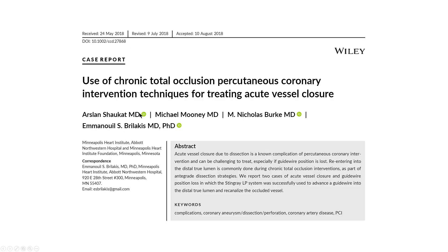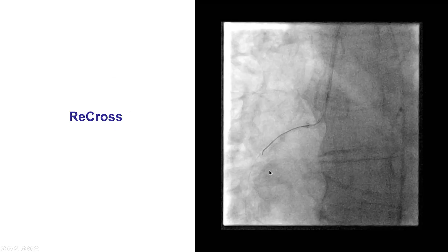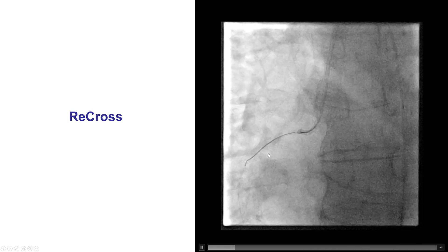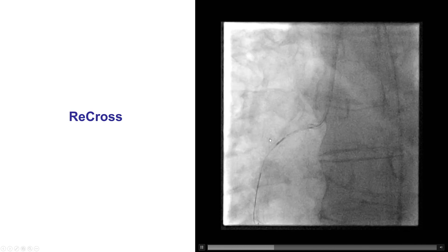What to do for cases like this? One option, since we did not have any EKG or ST segment changes, would be to just stop the case and bring the patient back after a month or two, allowing time for the dissection to heal — that would probably have been a fine choice. The second way is to try to get a wire into the distal true lumen, and sometimes CTO techniques — dissection reentry, antegrade as well as the retrograde approach — can be used. In this case, we decided to use antegrade dissection reentry techniques.